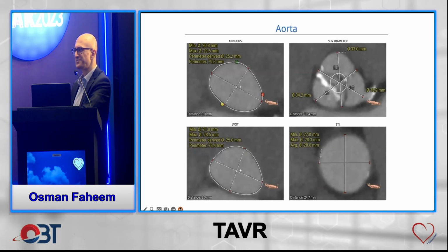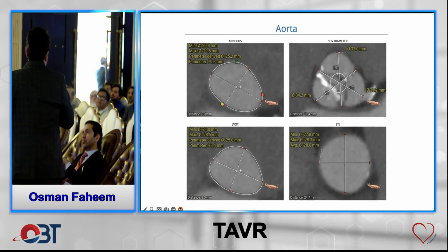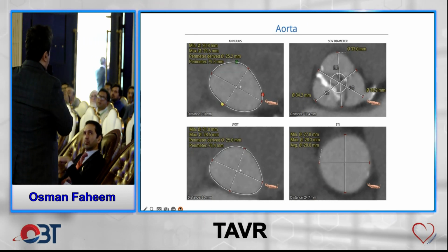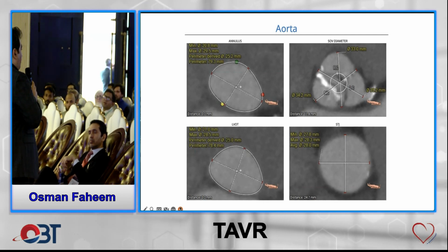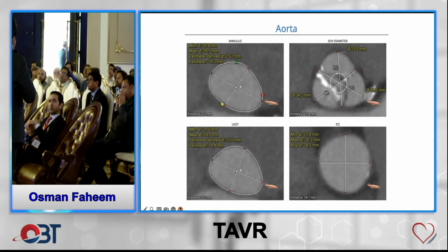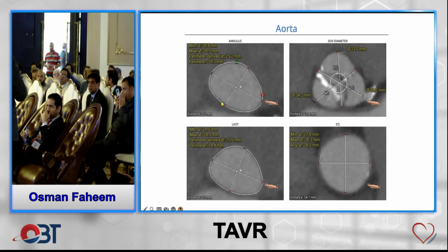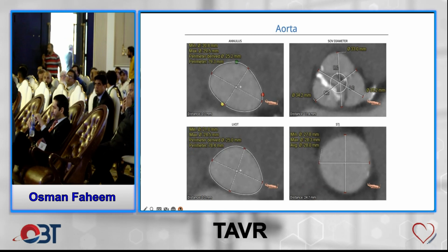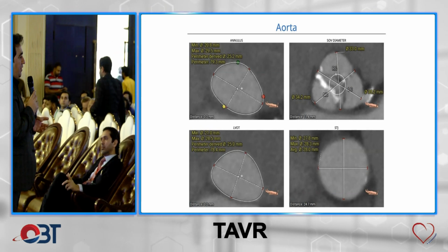Yes. So, if it's a bicuspid valve, remember this. Calcium is your friend to some extent, because without it you will not be able to do the TAVI. If it's a bicuspid valve and the leaflet is calcified, the raphe is calcified, that's your enemy actually. Too much nodular calcium or anything around that area is your enemy as well. So calcium, you have to treat like a friend.